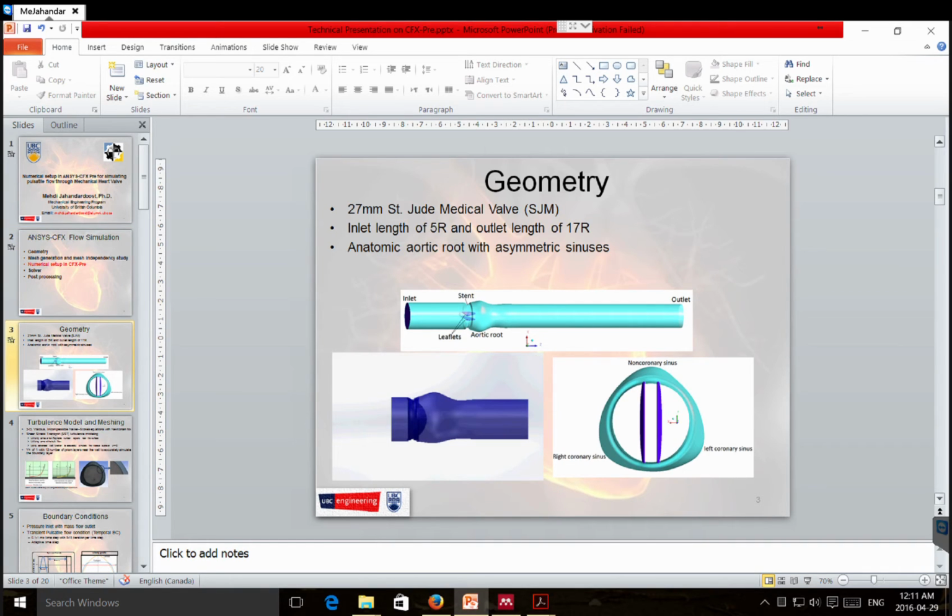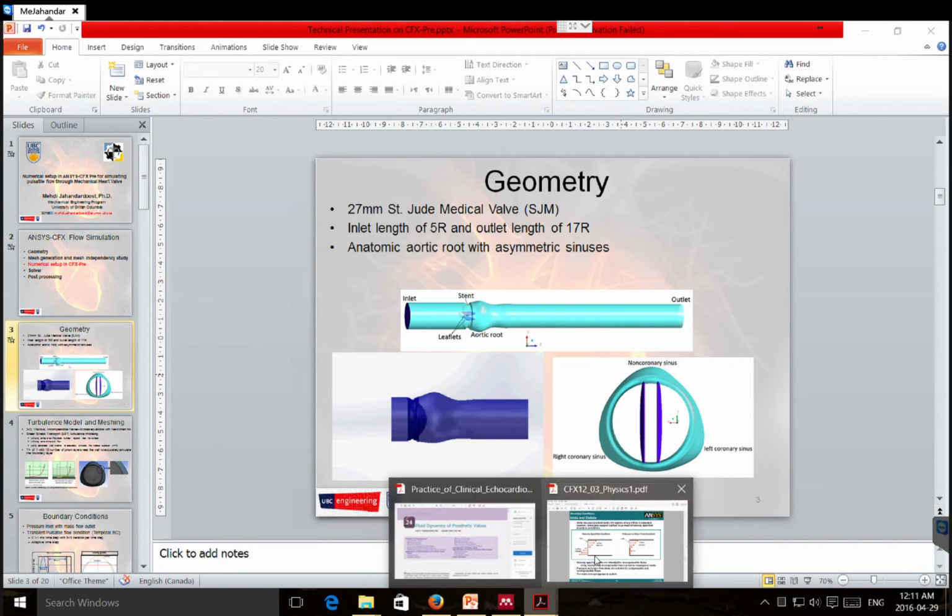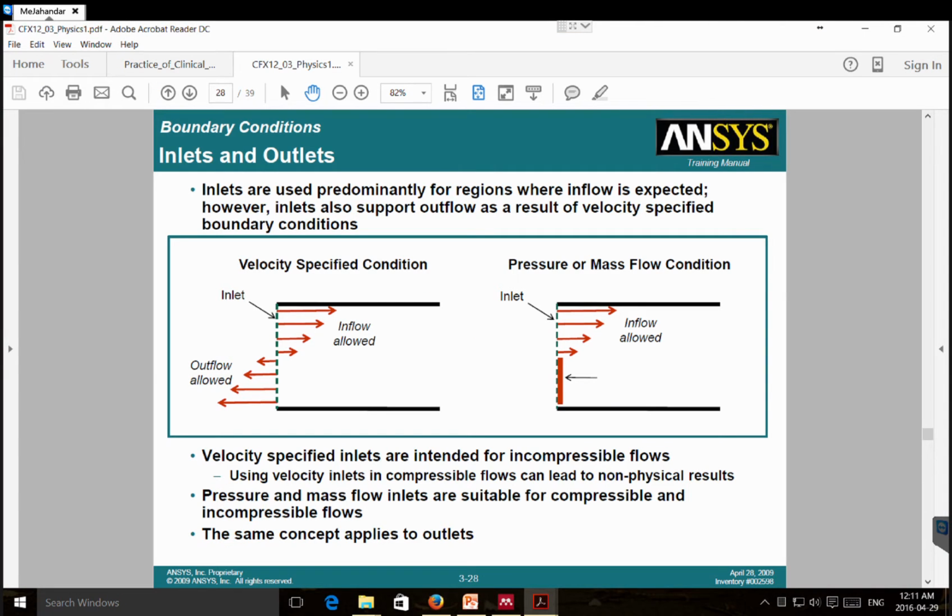First, about the geometry. The geometry that I have chosen is the standard St. Jude Medical valve, as you can see on this picture and here. I have chosen inlet length of 5R and outlet length of 17R. I have to explain for you the different combination of the inlet and outlet boundary condition. As you can see, you have some multiple choices for the inlet and outlet.